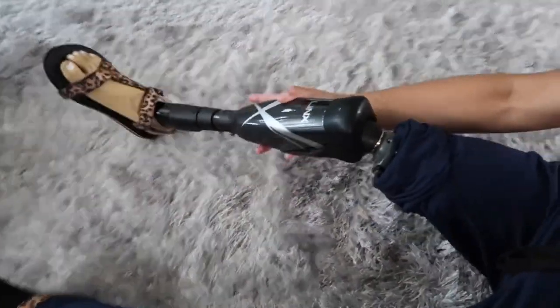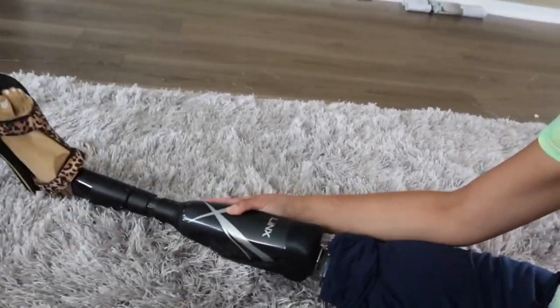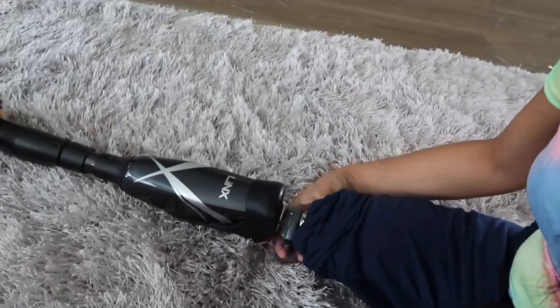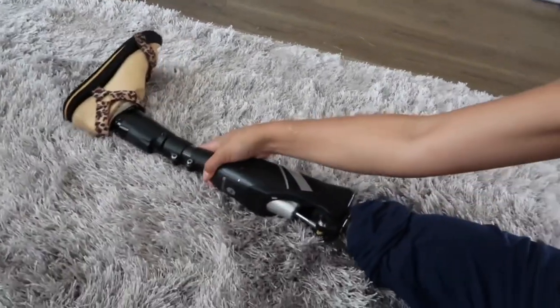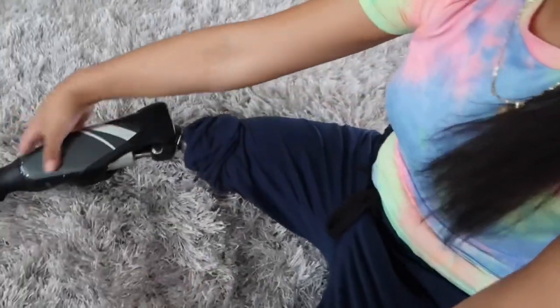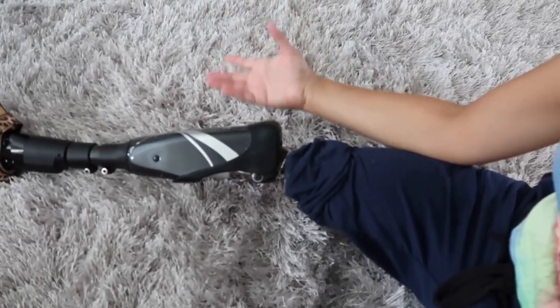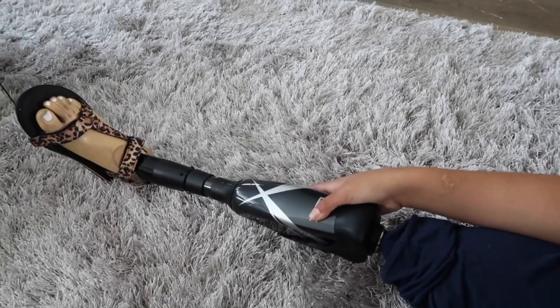So in order to put it back, I'll just put it straight back out and you'll hear a click. Y'all heard it? Okay, so that means it's locked in position, so I can't move it to the side anymore. So again, I press here, and you see how it went to the side? So now I'm able to put it in position. Again, to put it back to normal, you'll hear a click when I put it straight. The click should automatically come in action. So you're about to see. Y'all heard it? Okay, so that means it's good to go.